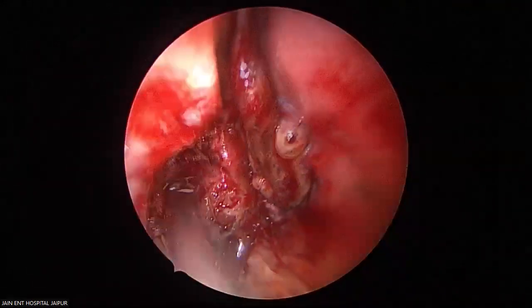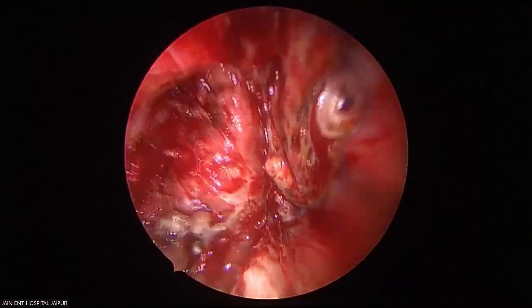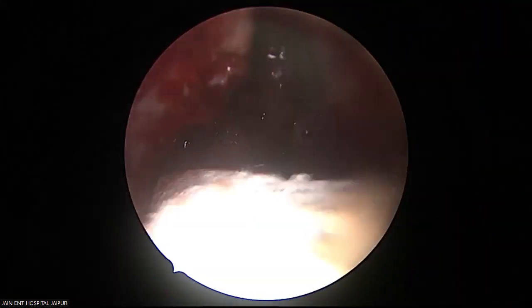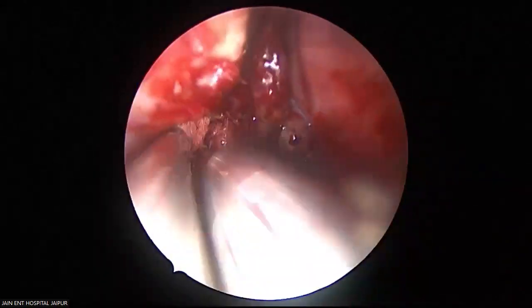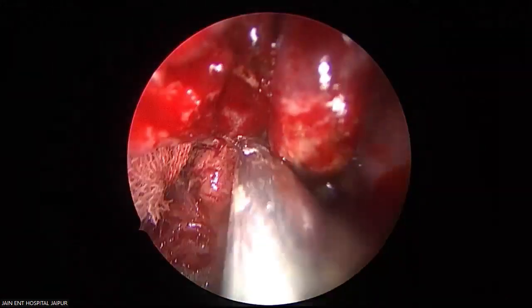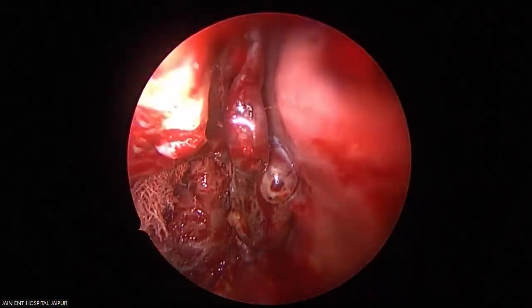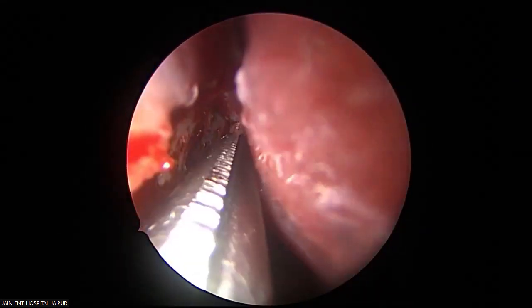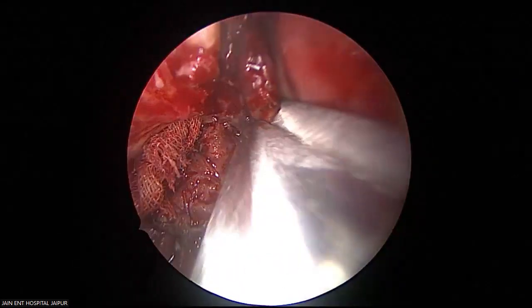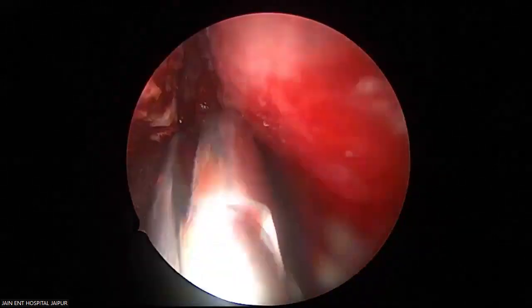I'll leave it here for a while. And then we have this anterior exposure, we have anterolateral exposure. Now we'll improve our exposure superior to it, behind and medial to it. Give me the scissors. See, the middle turbinate is involved here with the tumor. Very clear. So cut it, your target. Below it is involved with the tumor here. So I cut over here, just above that.